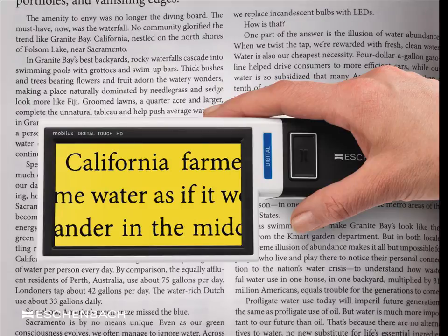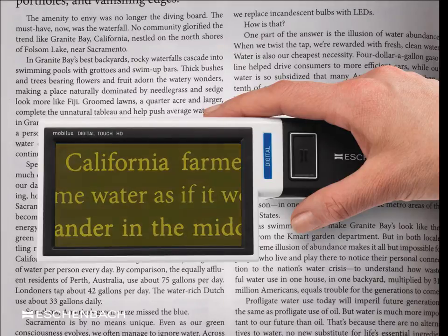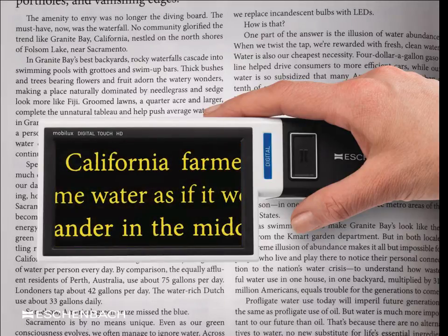Using the red touch-screen button, the colour of the text may be altered to suit the viewer — seen here as black text on a yellow background, or reversing the contrast to offer yellow on a black background. With the MobiLux Digital Touch HD, there are five viewing modes in total, including full colour, enhanced contrast black on white, and the popularly used white on black and reverse contrast modes.